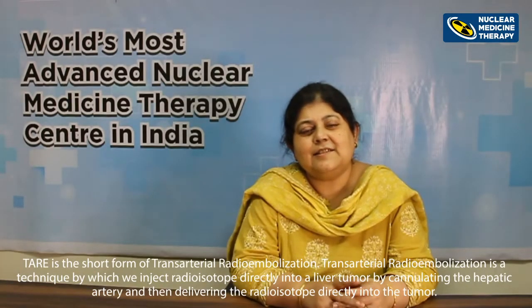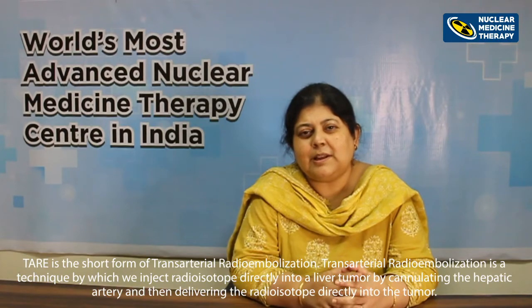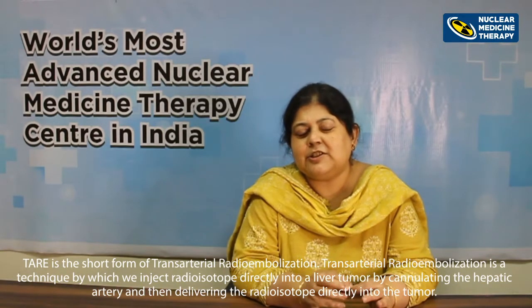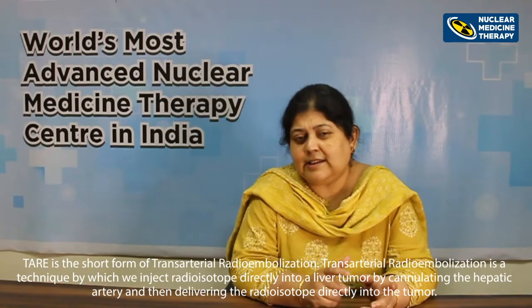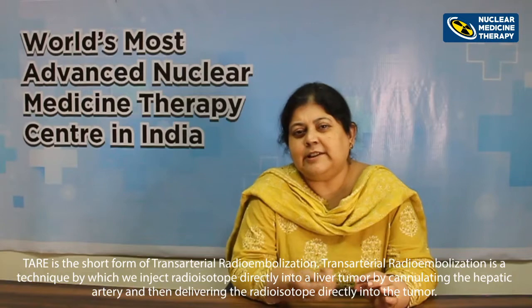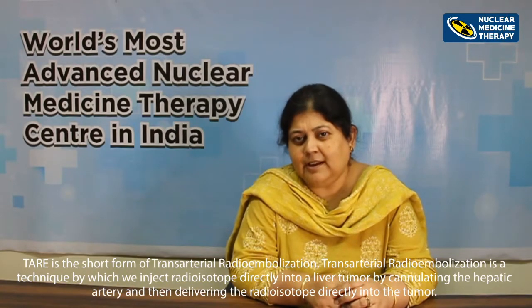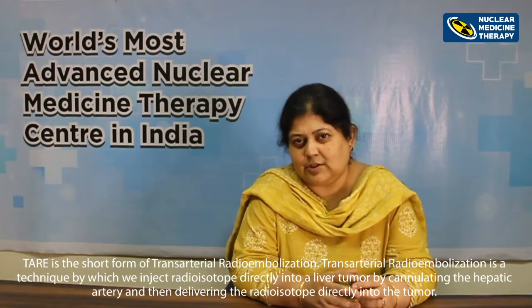TARE is the short form of transarterial radioembolization. Transarterial radioembolization is a technique by which we inject a radioisotope directly into a liver tumor by cannulating the hepatic artery and then delivering the radioisotope directly into the tumor.